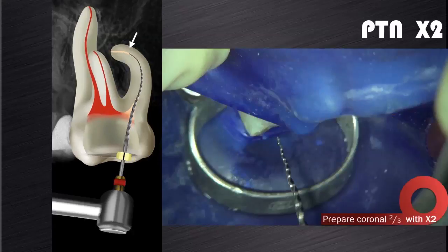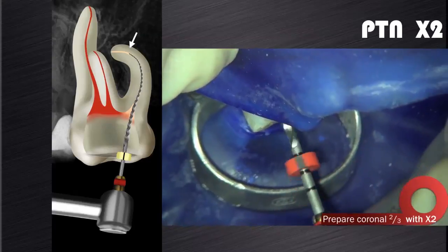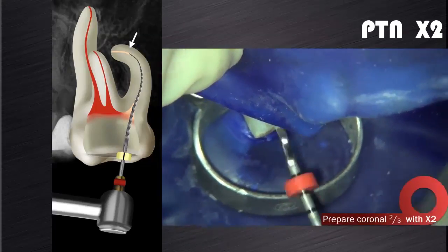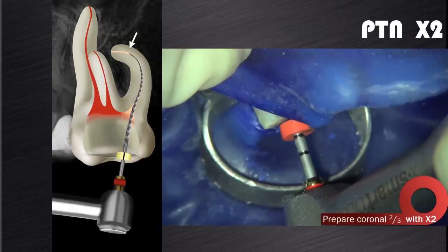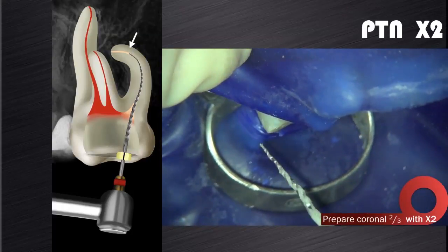Now here's my clinical tip. Instead of going back to the X1 for a second cutting cycle, I would recommend to you to introduce the ProTaper Next X2 and brush your way down to the same level as where the X1 previously hanged up in the canal. Then again, after that, check patency and irrigate and clean the flutes of the instrument.